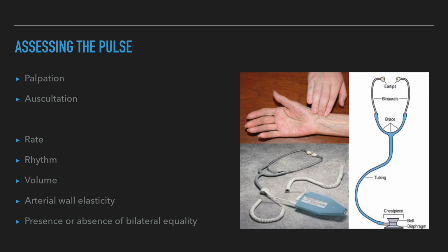Doppler assessment of the pulse is generally used to determine the adequacy of blood flow to an area for which occlusive vascular disease threatens the blood supply or for postoperative assessment where peripheral circulation can be occluded. The Doppler also may be useful when obesity or edema obscures the pulse, or in situations of cardiopulmonary collapse where peripheral vasoconstriction makes pulses difficult to palpate. Methods. Palpation and auscultation are methods used to assess pulse rate.